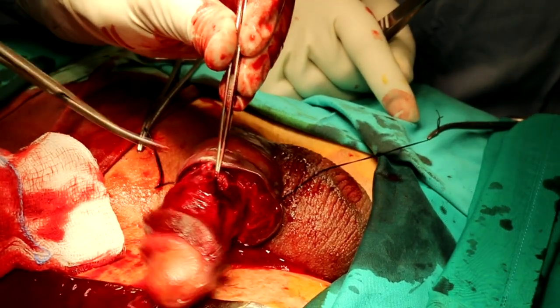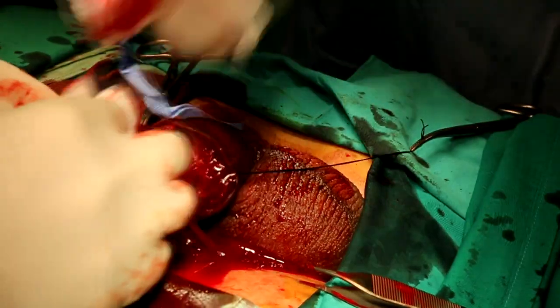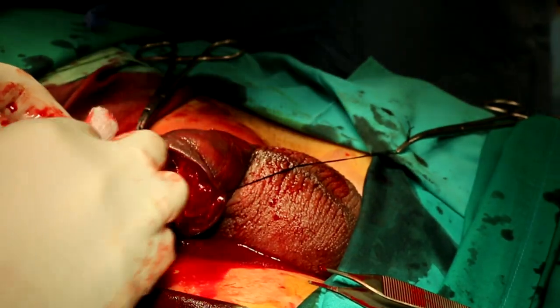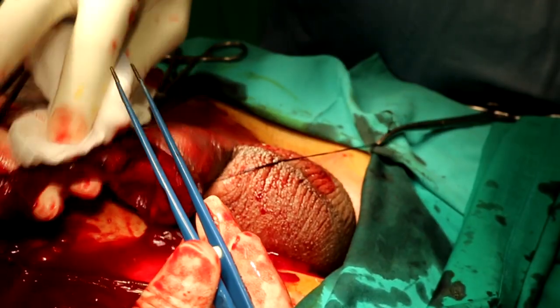So some people also said it can be explored through a penoscrotal incision or directly over the hematoma, but I still prefer this incision. As I said, it's a good exploratory incision for both corpora and also the corpus spongiosum. It's been chosen for any urethral tear. Just use bipolar if you want to use any thermal cautery.